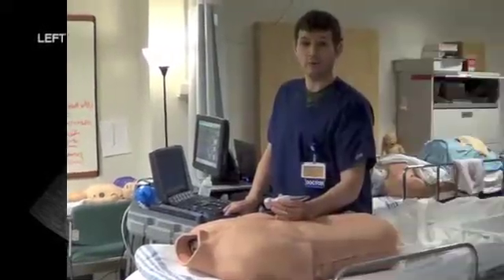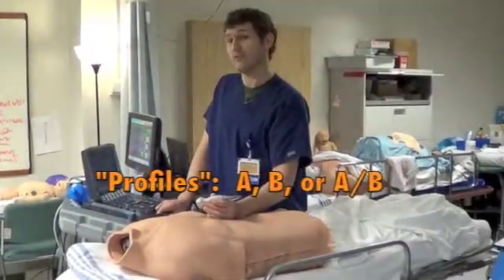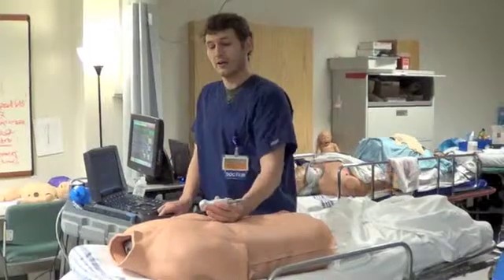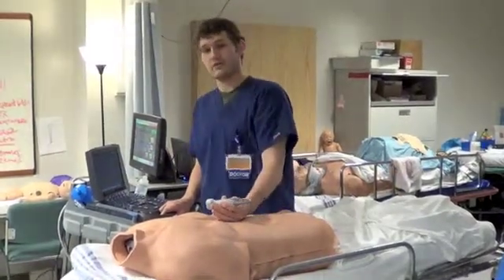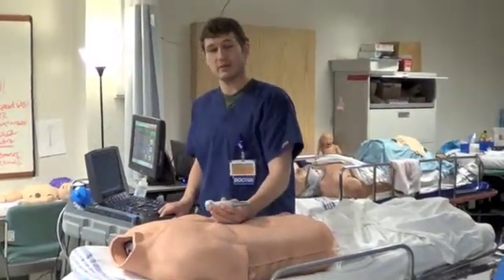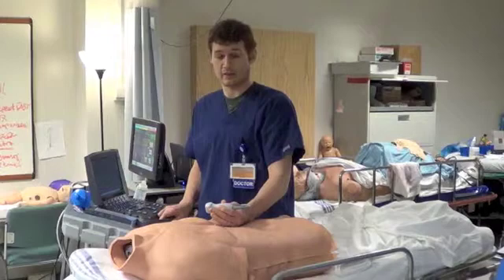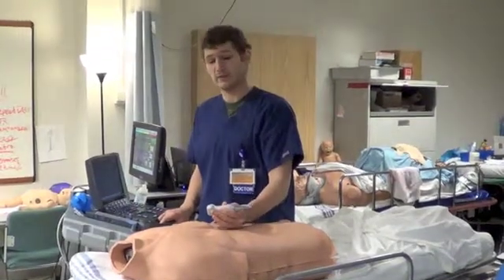We need to establish a profile on the patient — whether that be an A profile or a B profile — which is defined by the presence of A lines versus B lines, as discussed in another part of the ultrasound page.